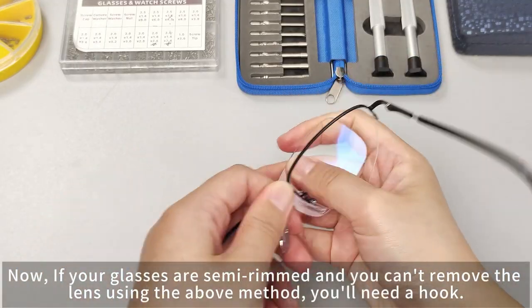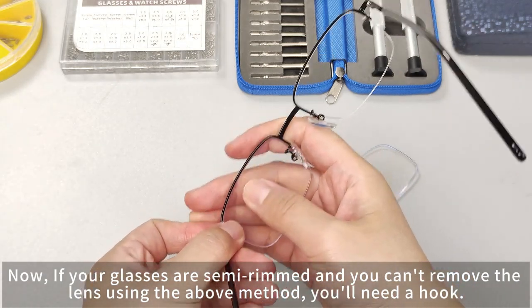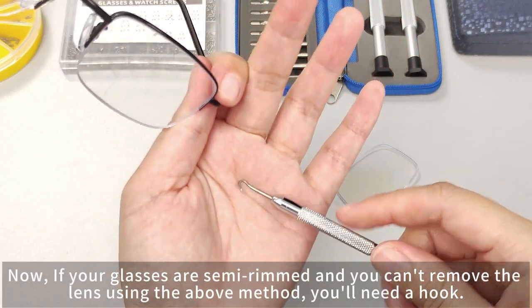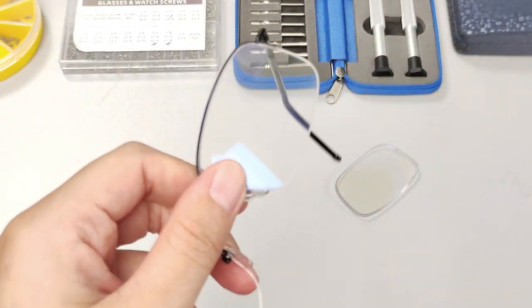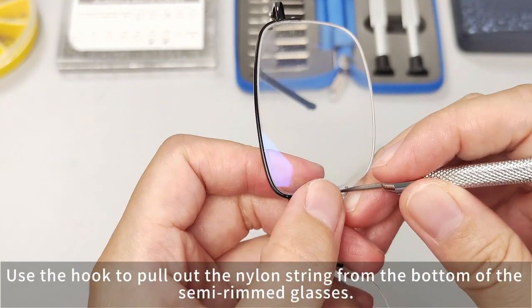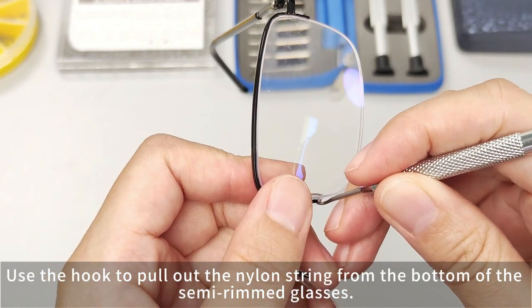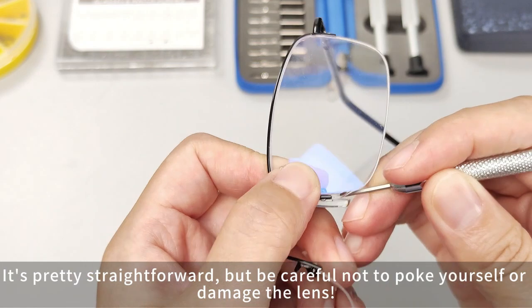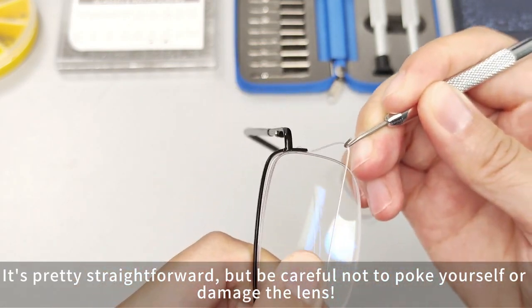Now, if your glasses are semi-rimmed and you can't remove the lens using the above method, you'll need a hook. Use the hook to pull out the nylon string from the bottom of the semi-rimmed glasses. It's pretty straightforward, but be careful not to poke yourself or damage the lens.